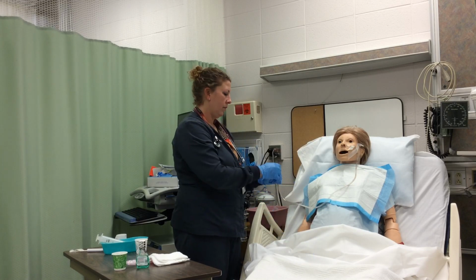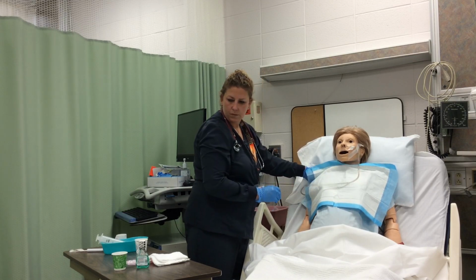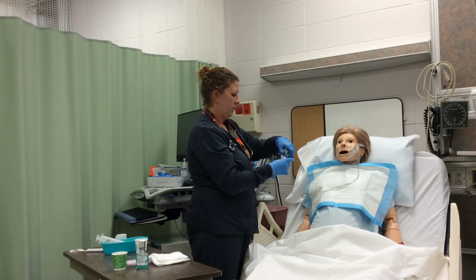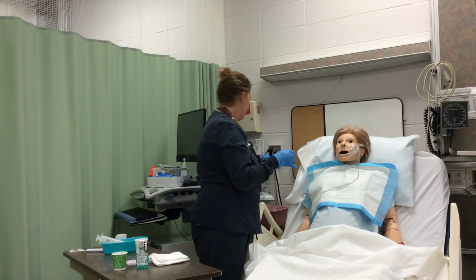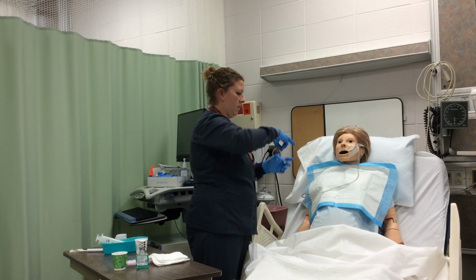Once the placement of the NG tube has been verified, secure it to the patient's face. Anchor the tube to the patient's nose, avoiding pressure on the nares. Mark the exit site on the tube with indelible ink. Select one of the following options for anchoring. So you can either tape it, you could apply a little tincture of benzoin or other skin adhesive to the tip of the nose.